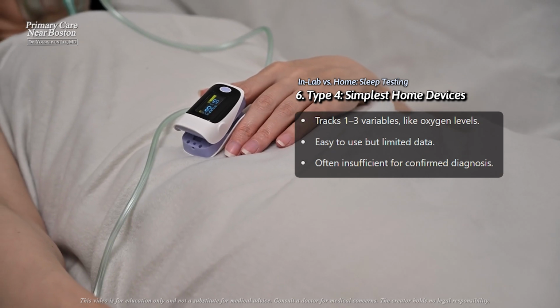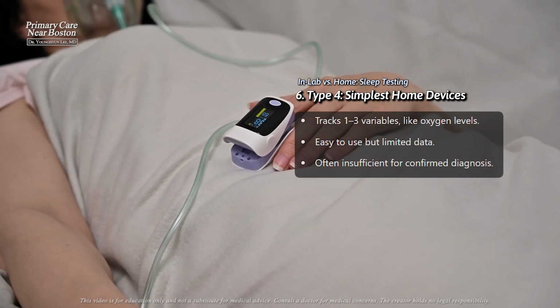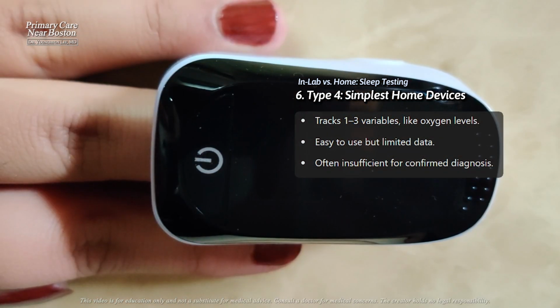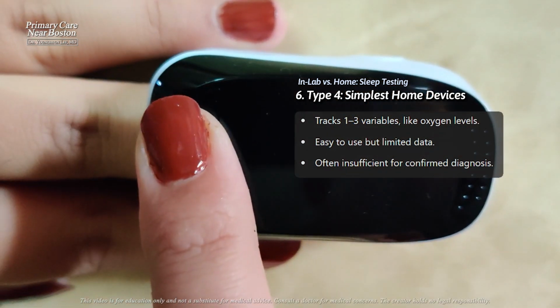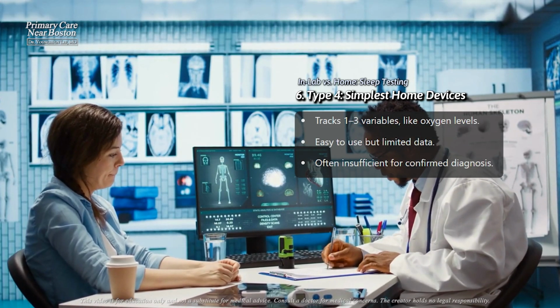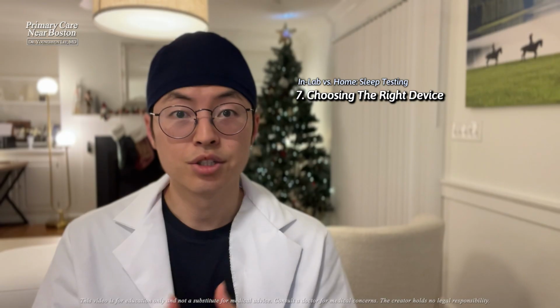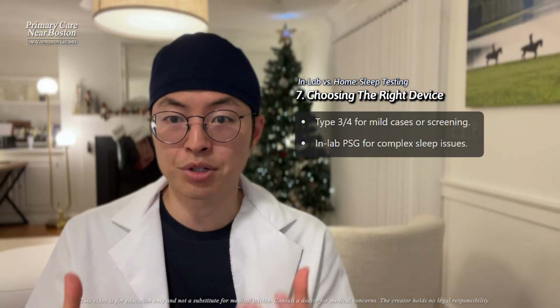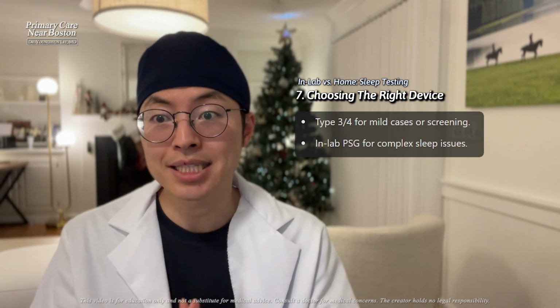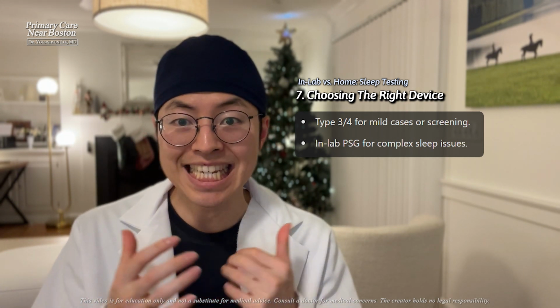While easier to use and convenient, Type 4 devices provide limited information, and results can sometimes be inconclusive due to the minimal data collected. Pulse oximetry alone, often classified as Type 4, may indicate drops in oxygen that suggest sleep apnea, but generally isn't sufficient to confirm a diagnosis without additional data. Generally, for people with milder symptoms or for initial screening, Type 3 and Type 4 home devices can be a good starting point, while complex cases may benefit from an in-lab PSG.